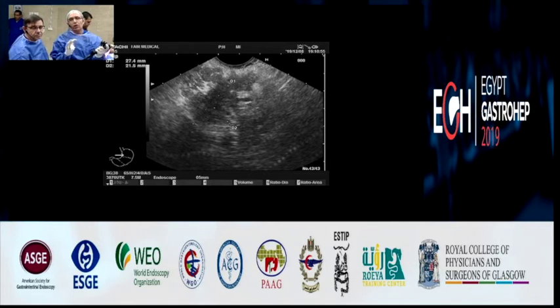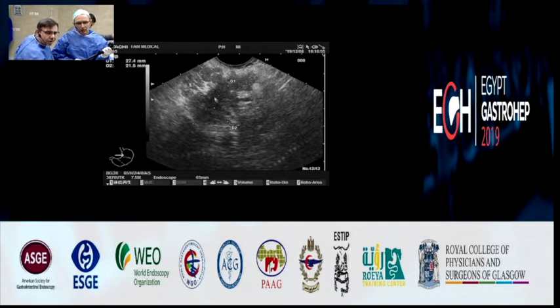If you see a lot of signs, we can tell for sure this is chronic pancreatitis. The problem is in the gray area. You have just a few signs, like this hyperechoic strand and lobularity, but then this could be anything, right? Can you tell this is chronic pancreatitis? I think no. This could also be a compression of the pancreatic tissue by the nodule here.